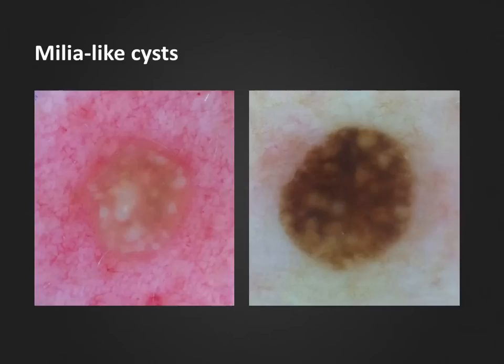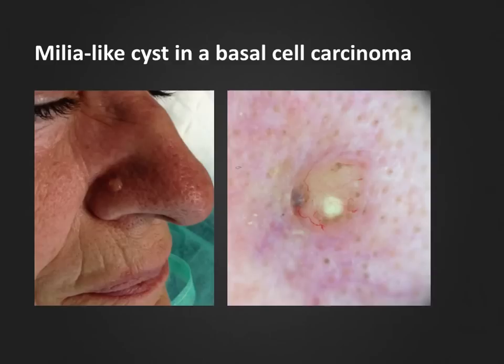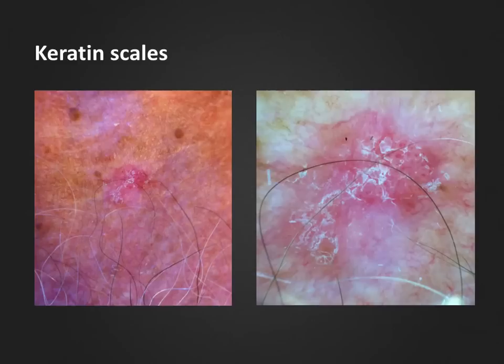One of the first white structures we learn about in dermoscopy are multiple small and round, whitish or yellowish structures that are regularly distributed throughout pigmented lesions that otherwise have a structureless general pattern. They are, of course, milia-like cysts — small intraepithelial keratin-filled cysts, which are typically found in seborrheic keratosis. However, when there are only a few or just a single milia-like cyst, one might have to look for other clues. In this case, there are multiple branched vessels, and at 9 o'clock we can also see a blue-gray ovoid nest, leading us to the diagnosis of pigmented basal cell carcinoma.